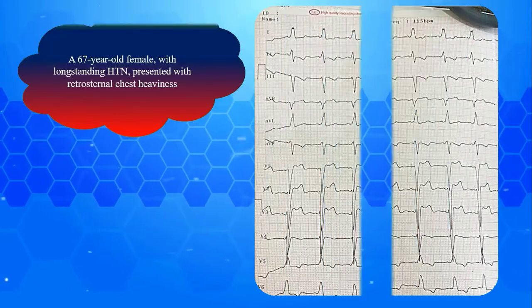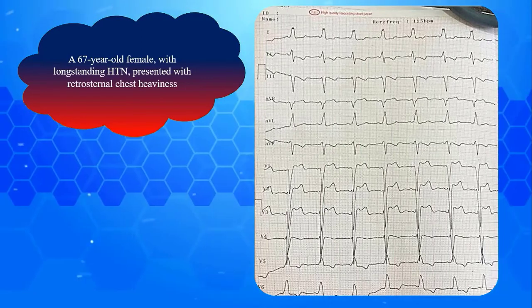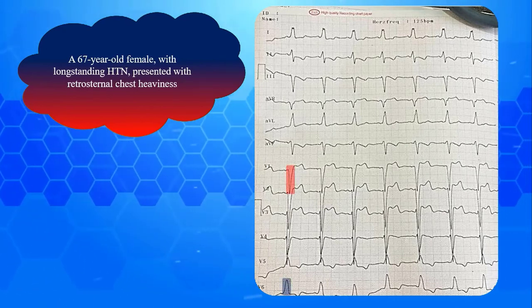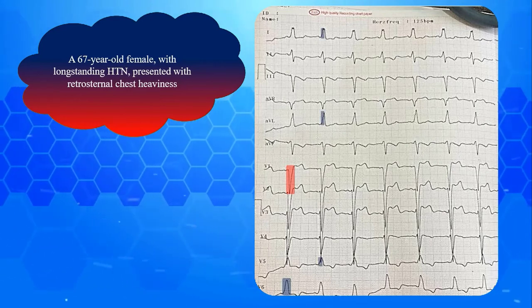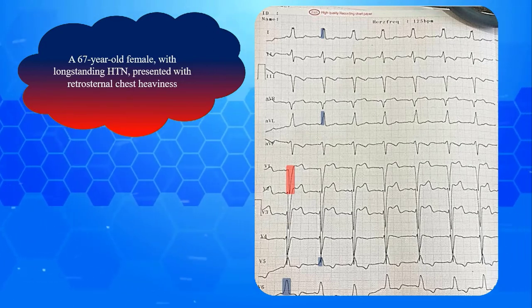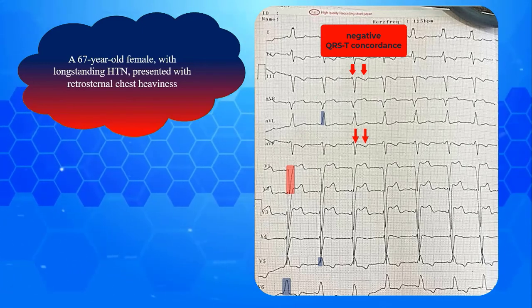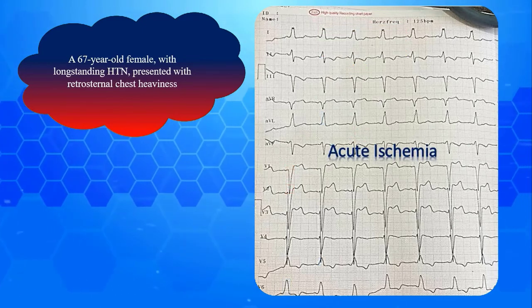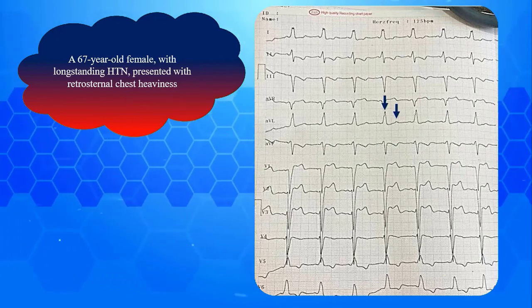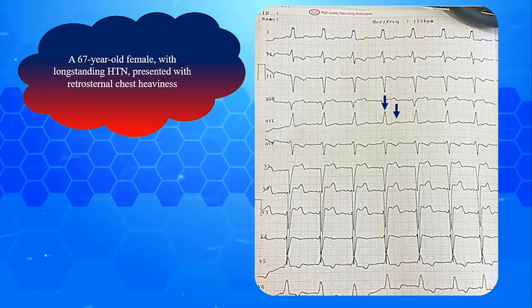Let me show you an example. This EKG belongs to a 67-year-old male with long-standing hypertension presented with retrosternal chest heaviness. Wide QRS complexes with deep S in V1, slurred R in V6, absent septal Q in lateral leads, and prolonged R peak time in V5, D1, and AVL establish LBBB. Secondary STT changes are present in precordial leads. Looking carefully at the strip, we recognize negative QRS-T concordance in D2 and AVF, which establishes acute ischemia as the most possible cause of chest heaviness. On the other hand, there is positive QRS-T concordance in AVL, which is normal in the context of LBBB and has no clinical significance.